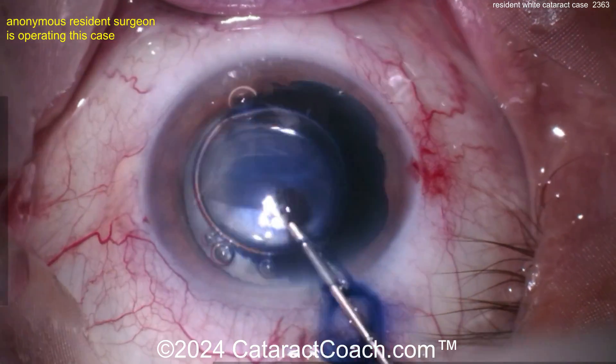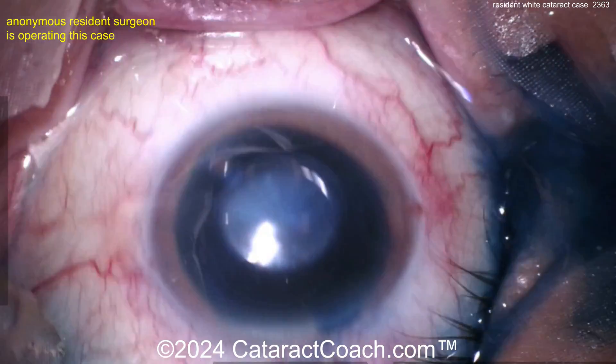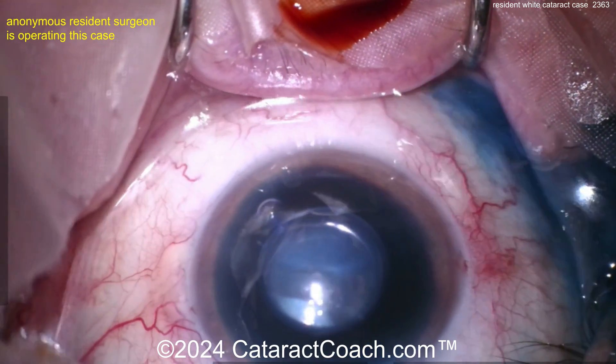Here comes trypan blue dye with a little bit of an air bubble — get that capsule stained. We'll fast-forward this a little bit here, and now once it's stained, get a nice good capsulorrhexis.